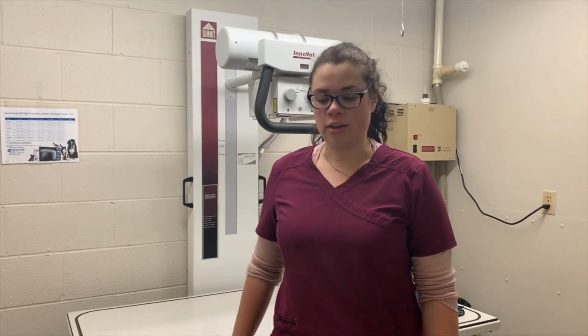The reason we do our barium studies is we're checking for any pet that comes in for vomiting, diarrhea, anything that makes us want to see how the GI tract is working, how it's running. We do it on animals that are chronic vomiters that have been going on for a while. We do it on animals that we may think could have a foreign body.